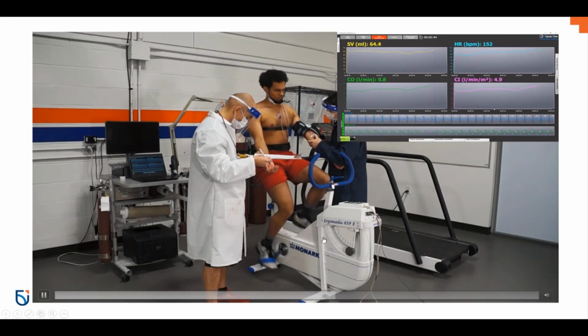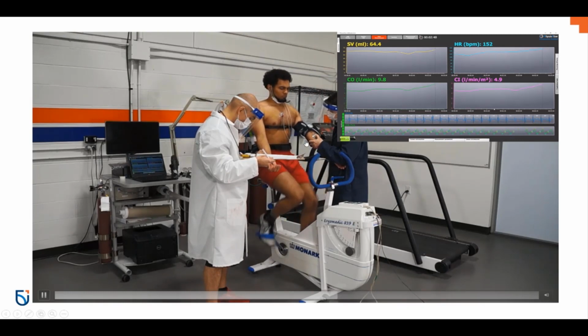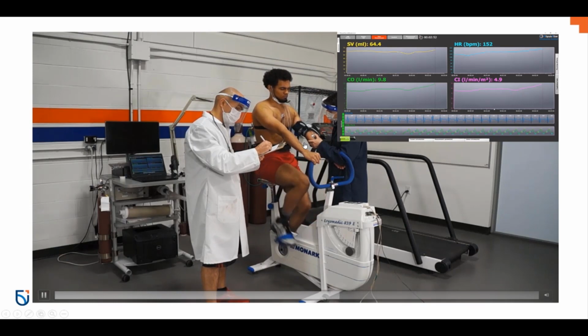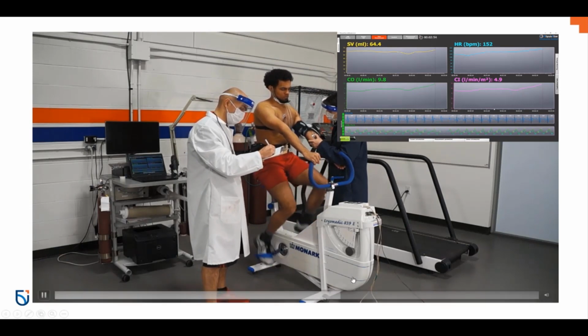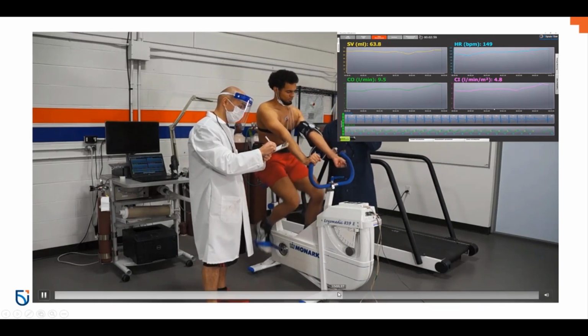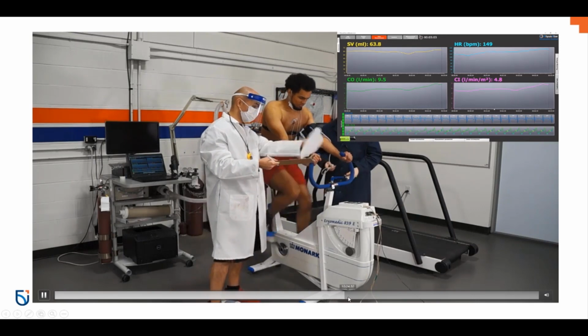Okay, so you can see that at the end of the warm-up stage here, we both take our measurements, and try to do it fairly quickly, as the participant has to have both arms sort of stabilized, and that's not the most comfortable position to bike in. But once he's good, we say, okay, you can grab the handles back again. Just sort of let our blood pressure cuff dangle there.